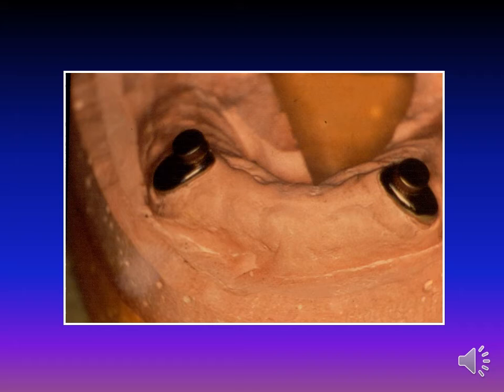Magnet retention is a popular method of attaching removable prostheses to either a natural tooth root or an osseointegrated implant. The magnet is usually cylindrical or dome-shaped, attached to the fitting surface of the acrylic resin base of the overdenture, and the magnetic keeper is cast to the metal coping cemented to the root surface or screwed over the implant fixture. This is the magnet keeper.